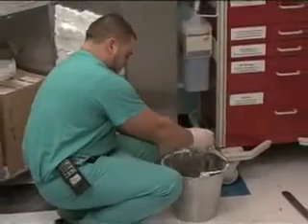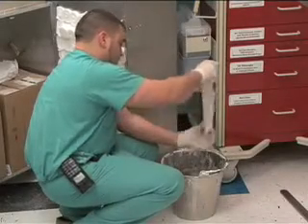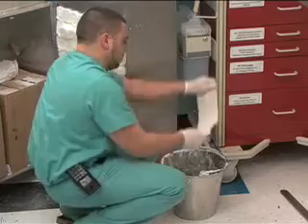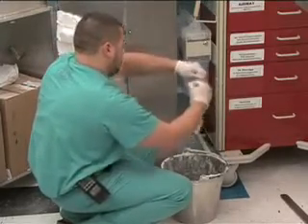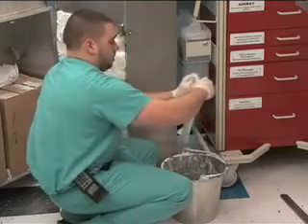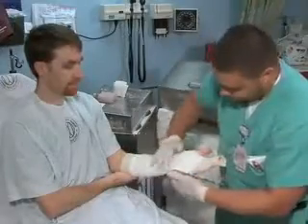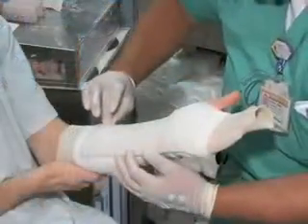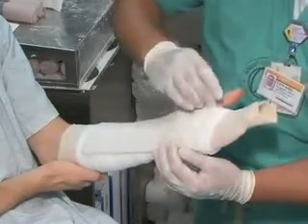Fill a bucket with lukewarm water less than 50 degrees Celsius and immerse the plaster material until it is saturated. Hold the wet plaster sheets vertically over the bucket and use 2 fingers to manually compress the layers in a downward motion. This removes wrinkles and excess water and will laminate the layers together. Place the plaster material over the cotton padding. Smooth the plaster to mold to the contours of the extremity in the appropriate anatomical position.